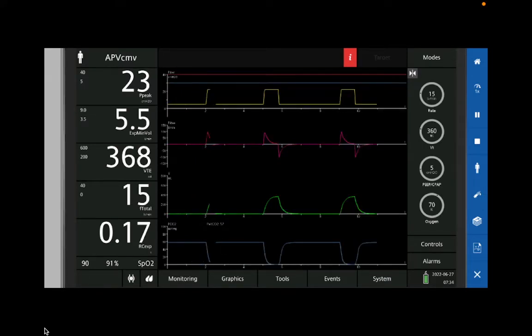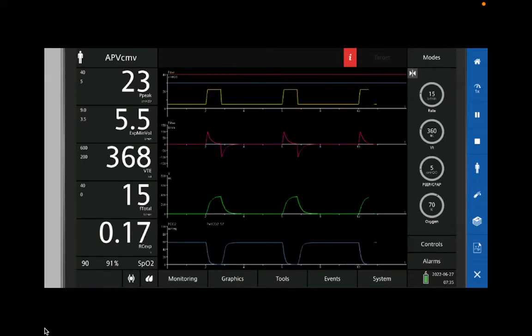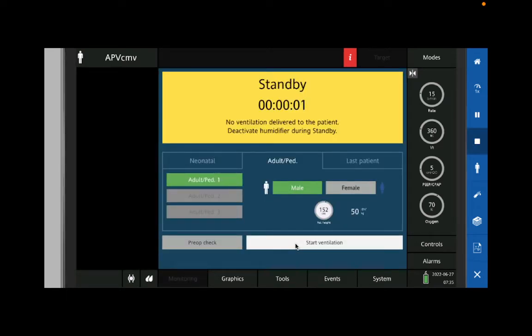What if you have a patient who's, maybe they're in DKA or some other metabolic acidosis and they're sucking back? Is the machine going to give them any pressure? No. You're going to see your pressure here being 5 or 0. So is your machine helping them anymore? No. So with those two types of patients, you probably don't want to use PRVC.